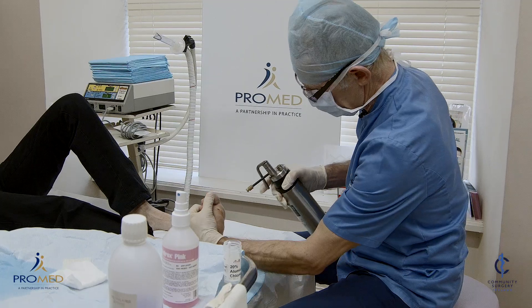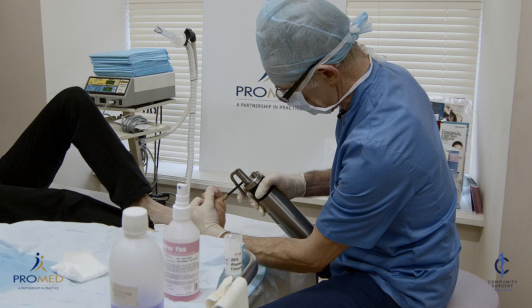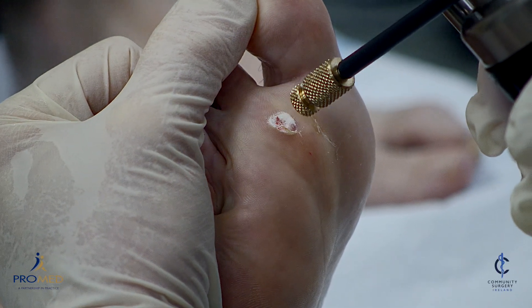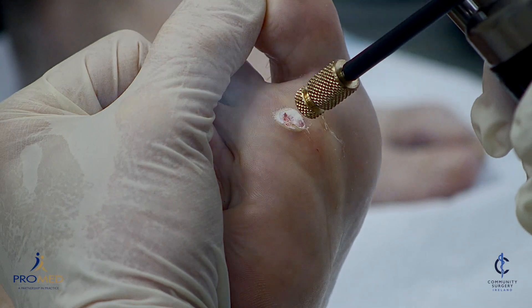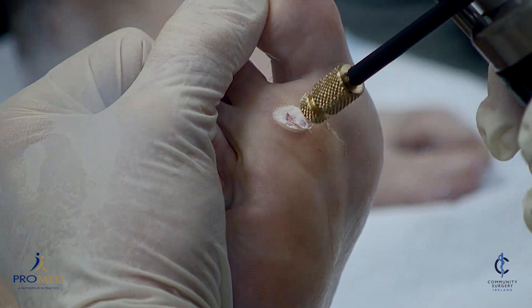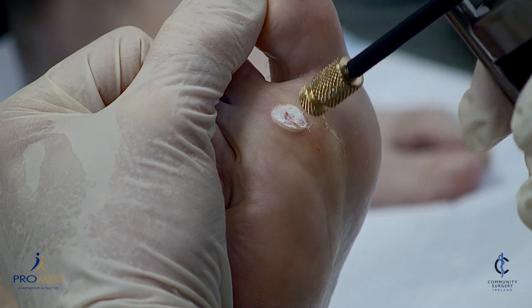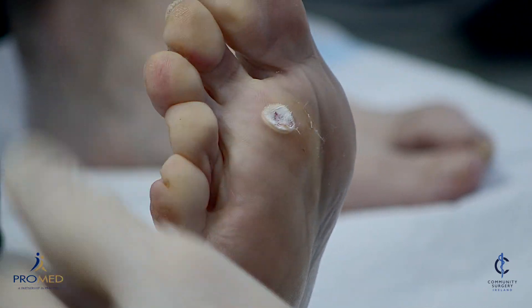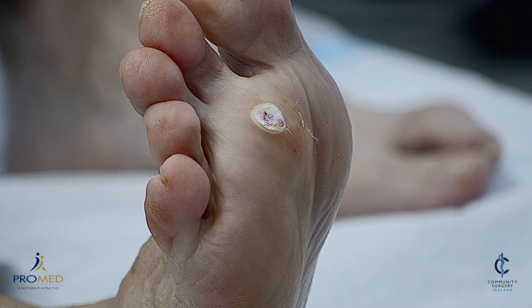Now we're going to freeze for 10 seconds and two freeze-thaw cycles. So freeze — keep freezing until it's all gone into ice — and now for 10 seconds: 9, 8, 7, 6, 5, 4, 3, 2, 1, 0. So that's a 10-second freeze cycle and we're going to do it twice. It's going to take about a minute for this to thaw out.